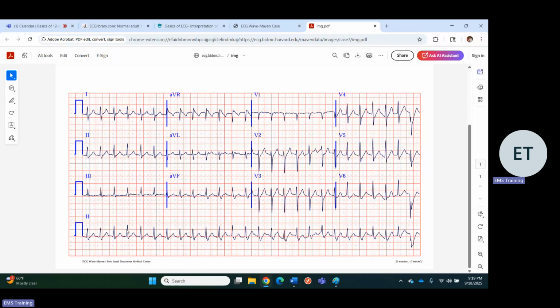Well, I don't know. Anyways, let's see the axes. Thumb up, thumb midway. So although I wouldn't call this right axis deviation, I would definitely say it's leaning a little bit towards the right. Tachycardias, the faster the heart rate is, can start to produce an aberrancy-like thing. So it's not surprising that with a faster heart rate, the axis is shifting a little bit.